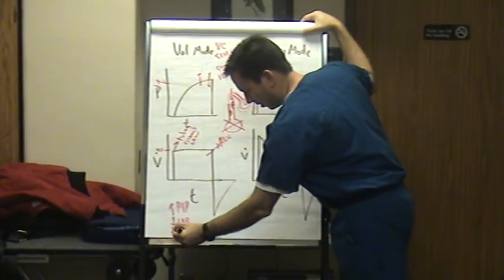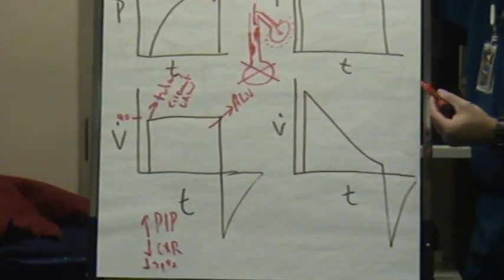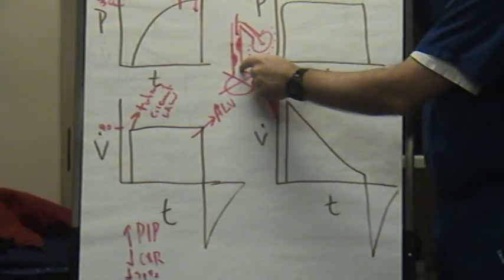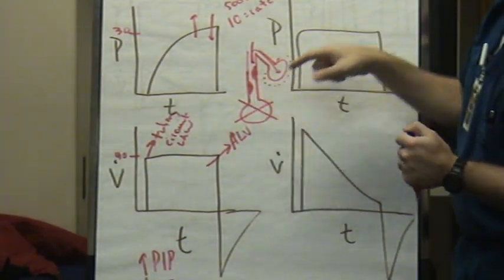So I'm going to tell you that when the therapist calls you and says, hey, look, our x-ray's looking crappy, that's a technical term, isn't it? But our x-ray's looking crappy and our peaks are climbing, then you know that this is happening down the airway. You don't need an x-ray. You don't need x-ray vision. X-ray will help you, but you know that at that point that's happening.